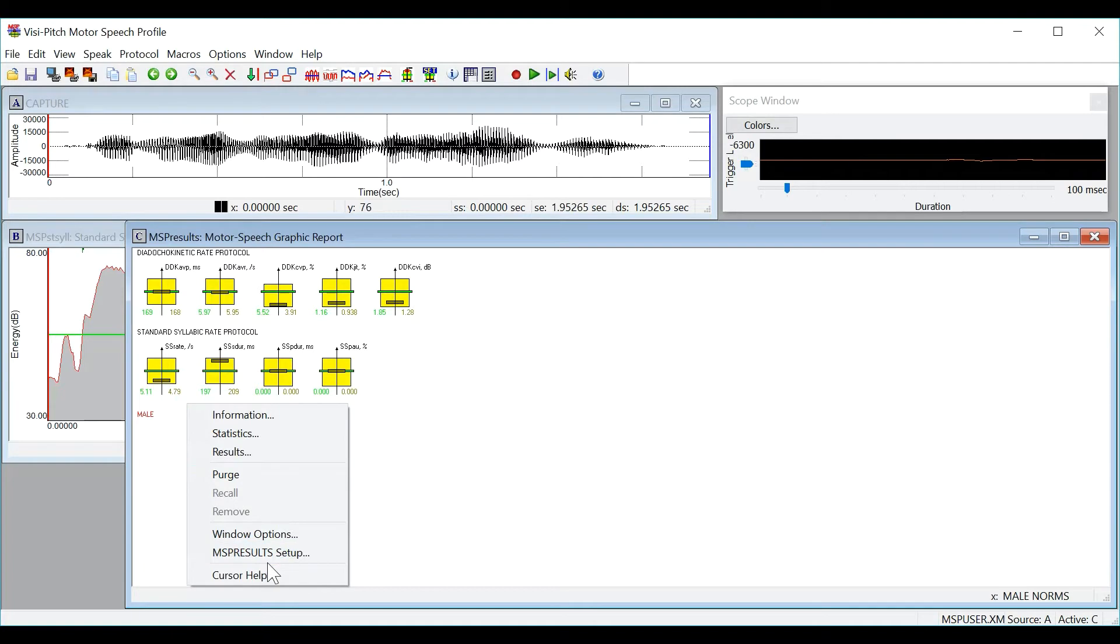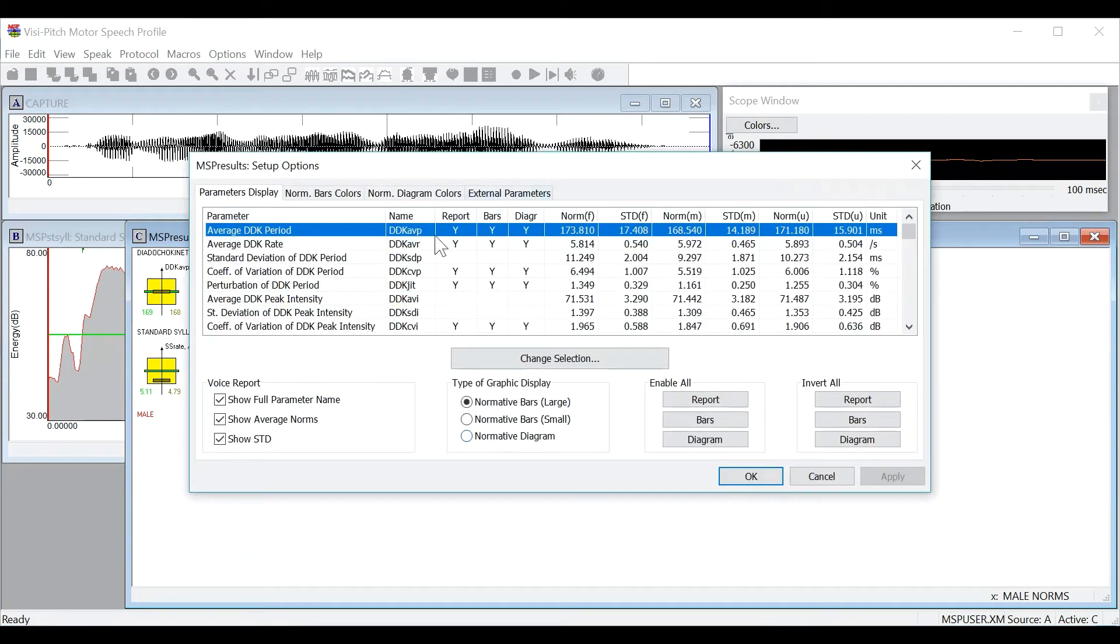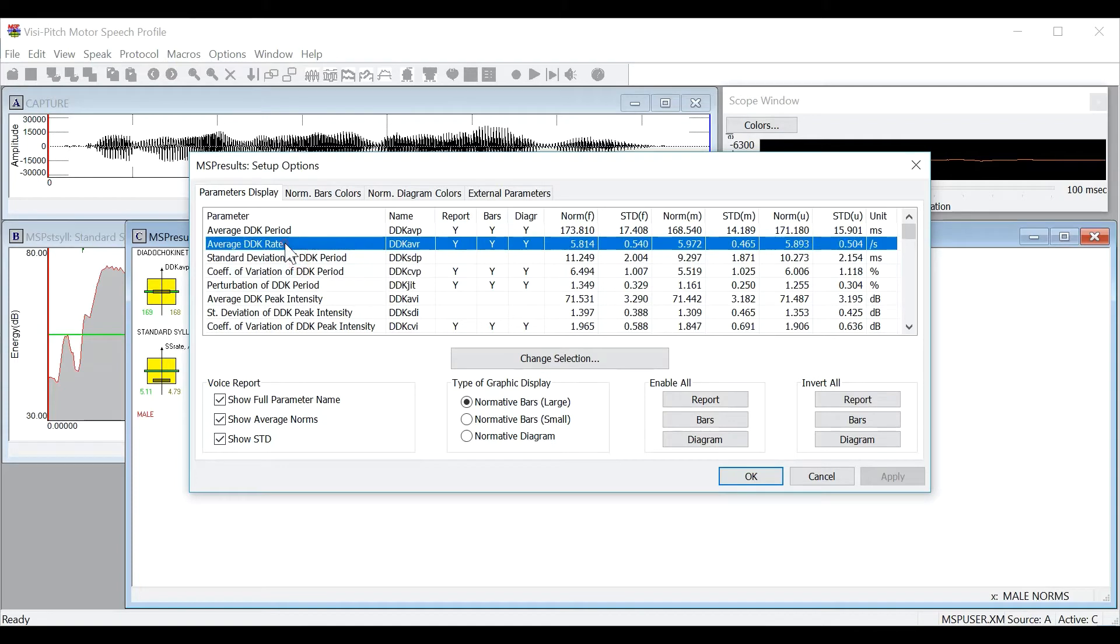You can also click on MSP results setup to change all of the results that are displayed as well as the colors for the bars.